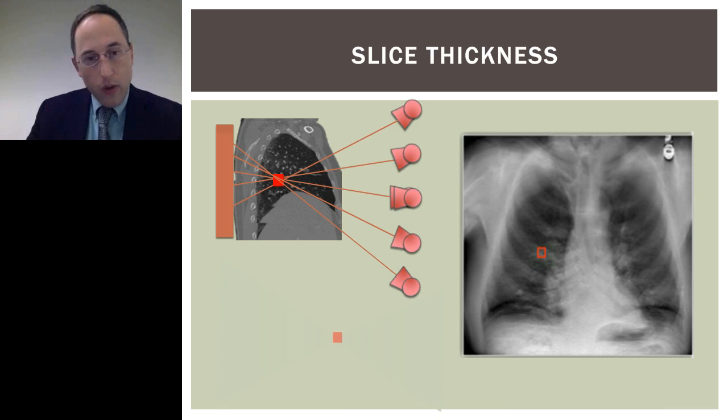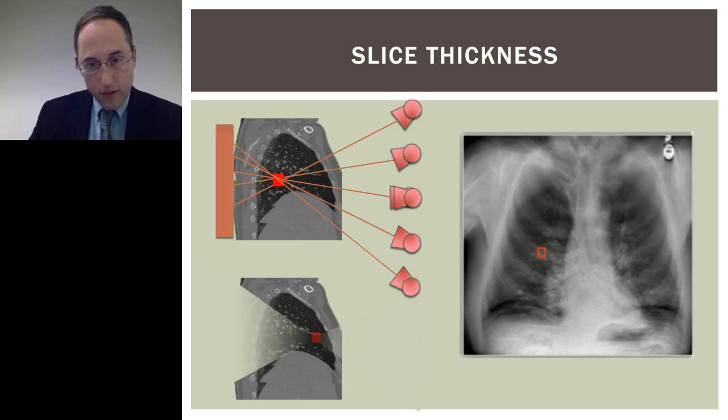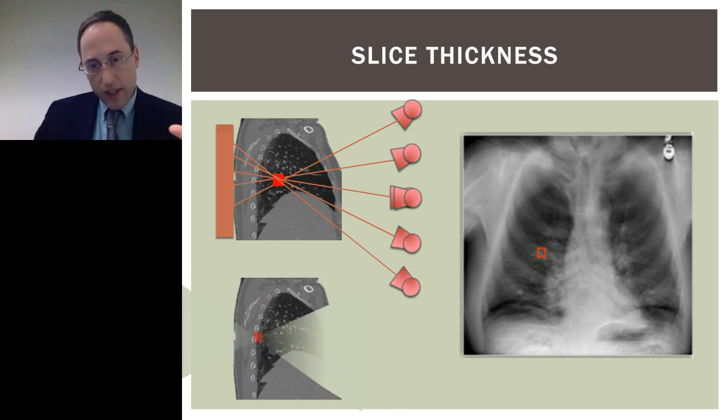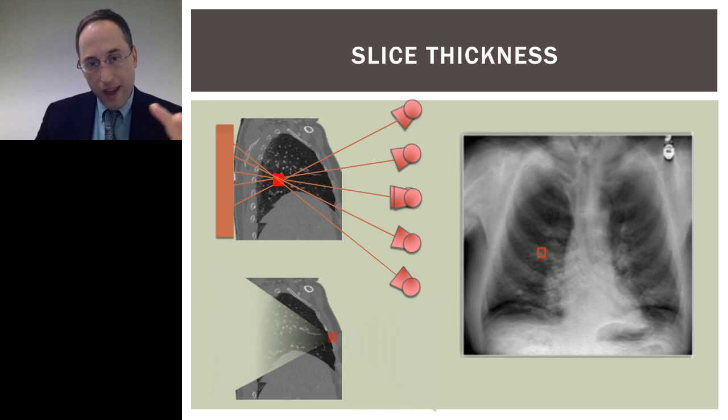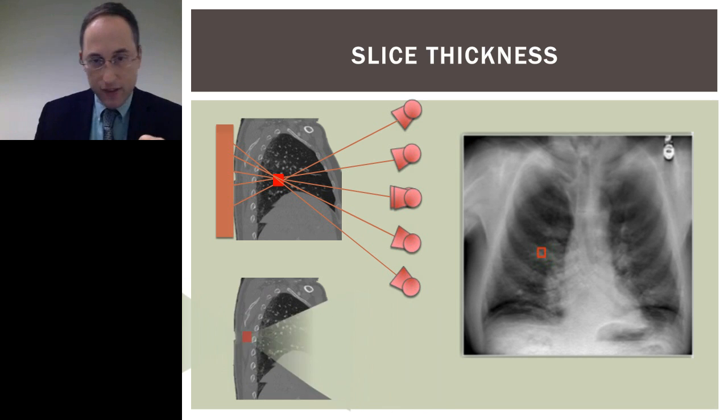All right. So when you scroll through an image, if you are looking at the same location and you're scrolling through a stack of tomosynthesis images, the thing that is actually making up those pixel values is shown on the bottom left. So for each slice, you would sum together all the values and put them into the red box for that given slice.